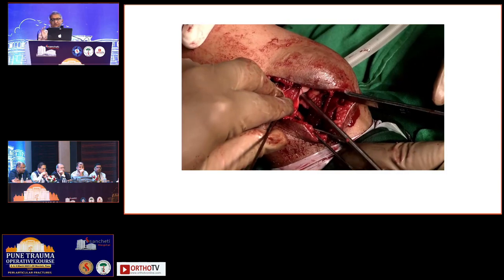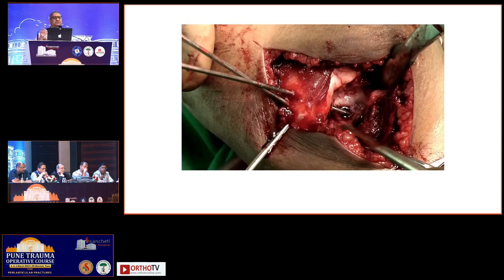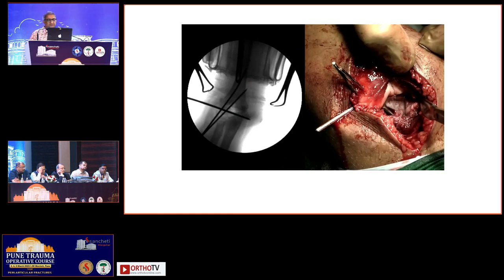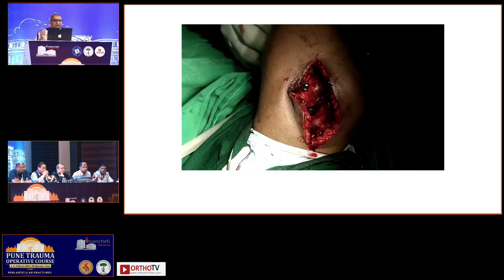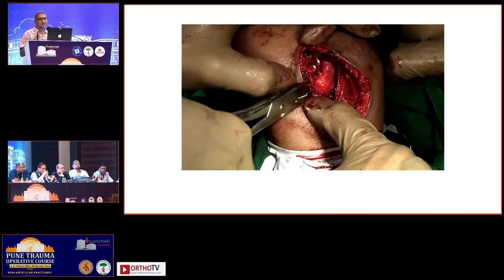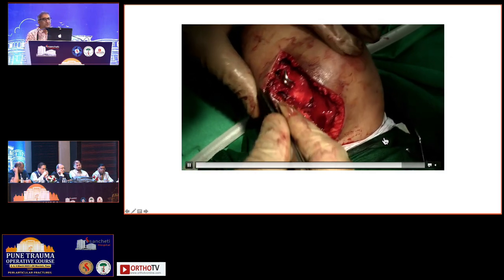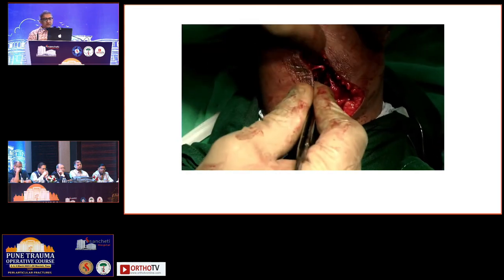And then it was fixed with two K-wires, one going parallel to the joint and the second going through the olecranon fossa, because this is a 4-point fixation and gives a very solid fixation here. This child did not have a big metaphyseal fragment, so I did not put a screw, but we put three wires and buried all of them inside the skin, because this fracture will take a longer time to heal and you don't want to keep the wires out and remove them prematurely. And that's showing the closure.